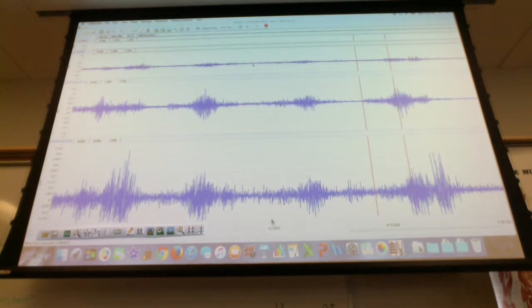Okay. So does everybody find an extension? So can you just repeat what you want them to record? Okay. So first of all, on the first row, you should have three numbers, an average for the flexion, what's going on the anterior, what's going on the posterior. Does everybody have that? Okay.